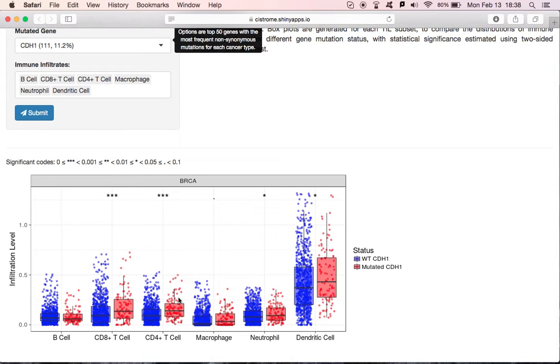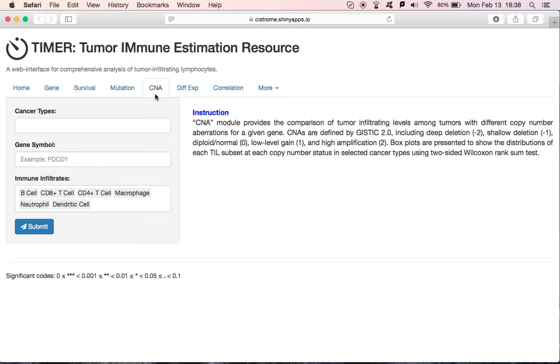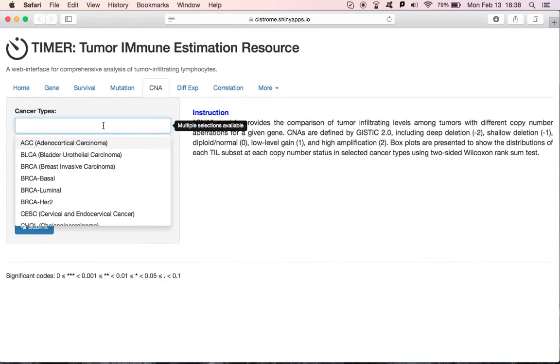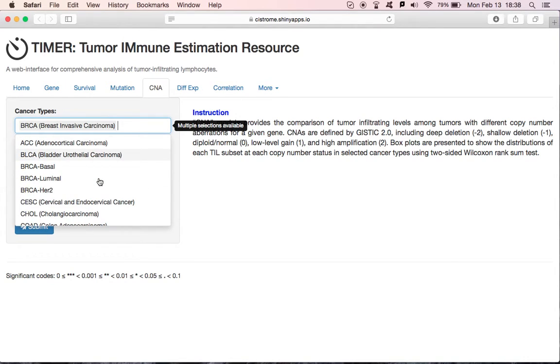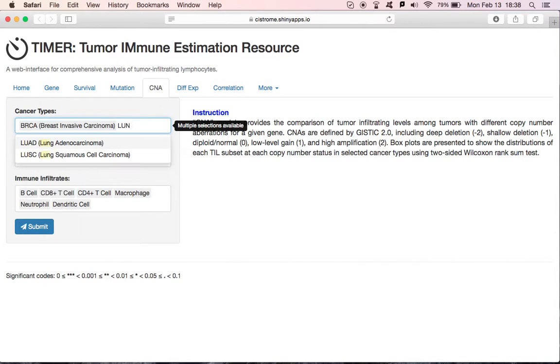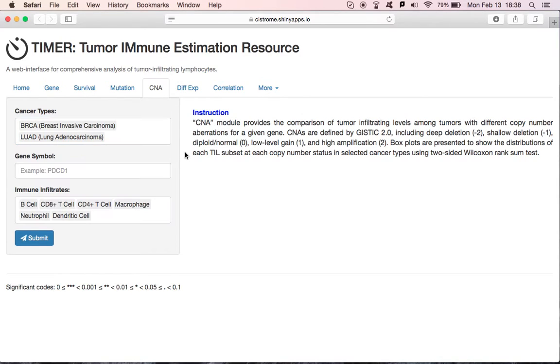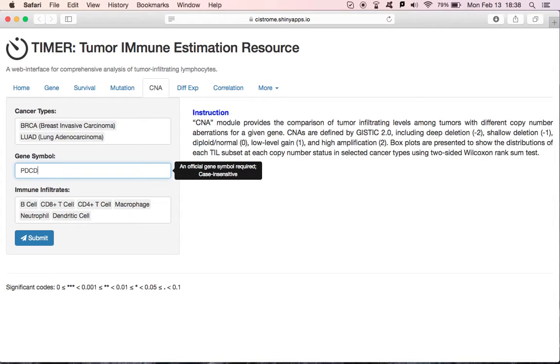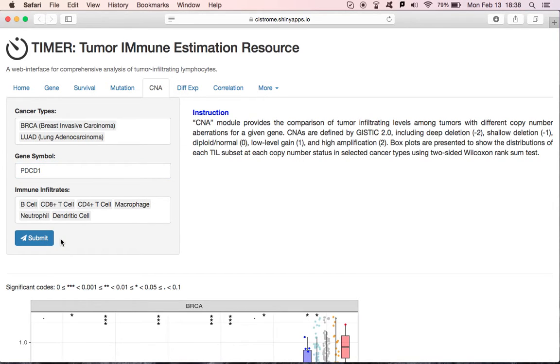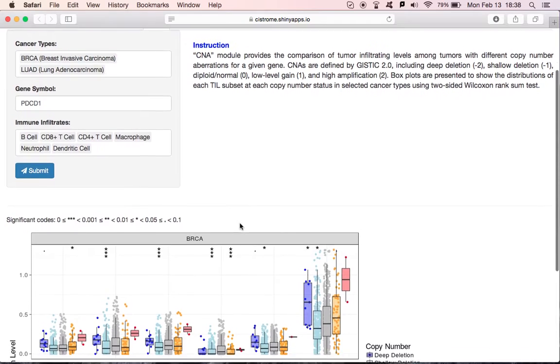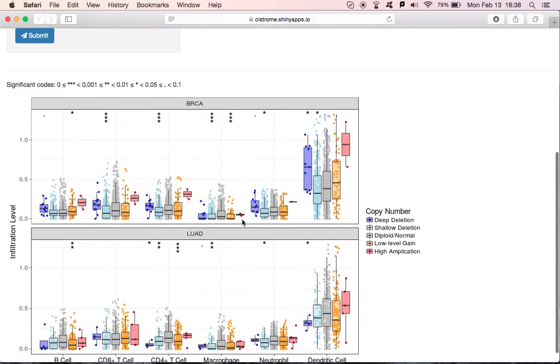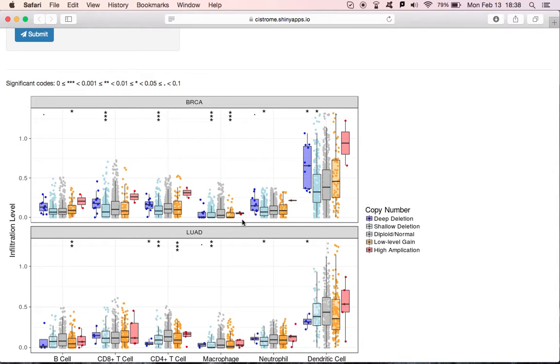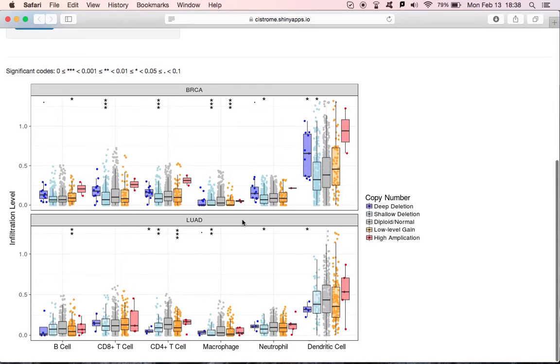Same with the mutation model, we could use the CNA model to compare tumor infiltrating levels among tumors with different copy number aberrations for a given gene. Say we choose breast cancer, and lung adenocarcinoma, and we input PDCD1, and click Submit. Box plots are presented to show the distributions of each TIL subset at each copy number status. The significance is tested for comparison of each status to normal status and labeled at the top of the plots.